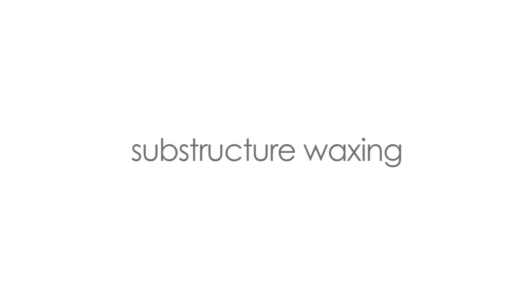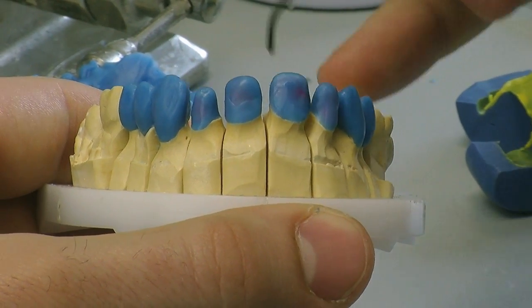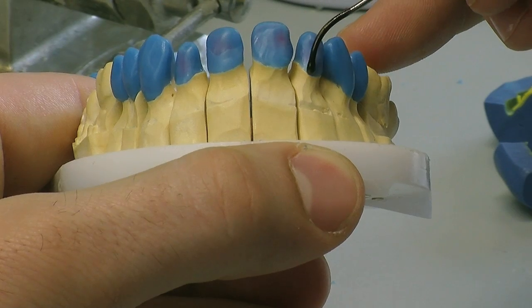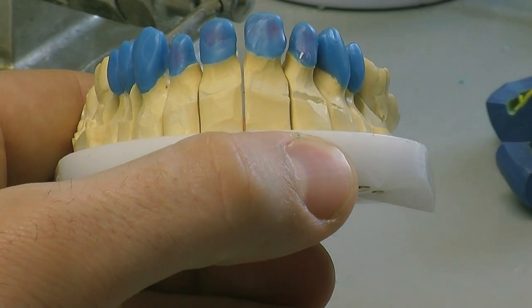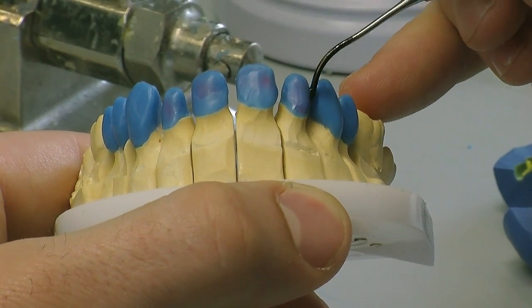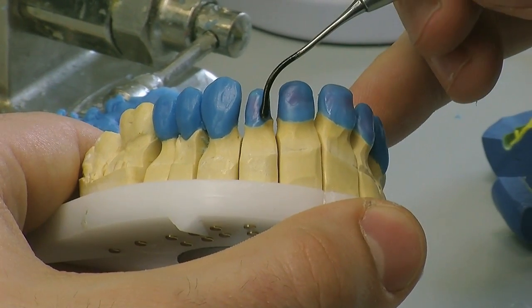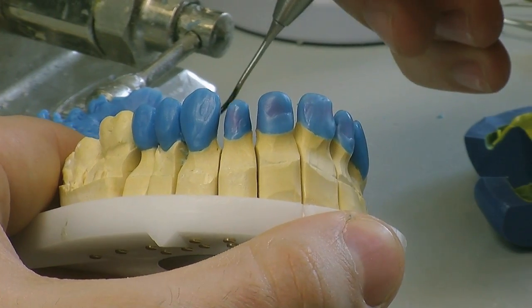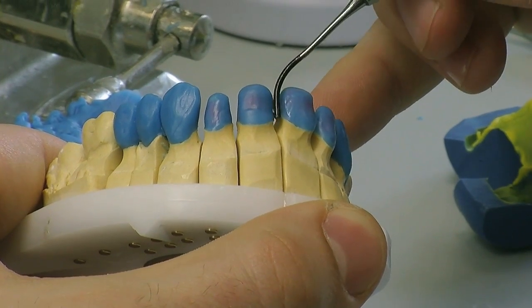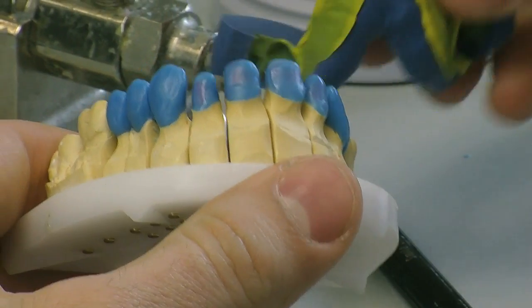The case has been brought into the lab and we've made our models, we've articulated them, and we've used the Luxor bites provided by the dentist, extremely accurate, cut down, trimmed and skimmed. So effectively we have a really nice little bite wafer which is very accurate. We've then mounted this up on our articulator. We've done our copings on the anterior section and we've already waxed up our posterior section as to the trial smile model, which is taken when the temporaries have been finalised.